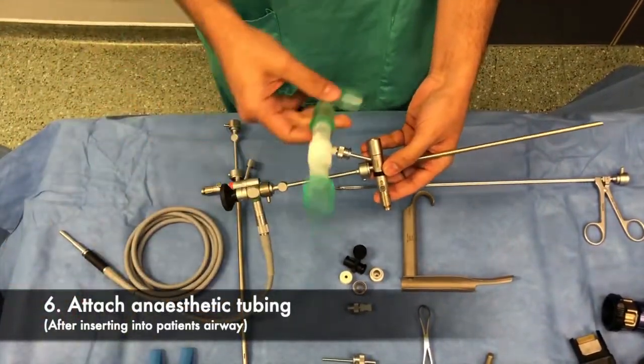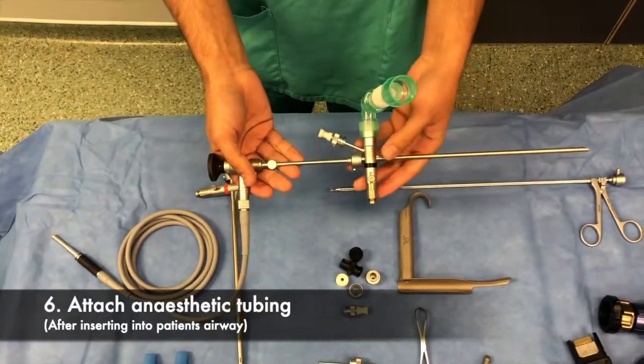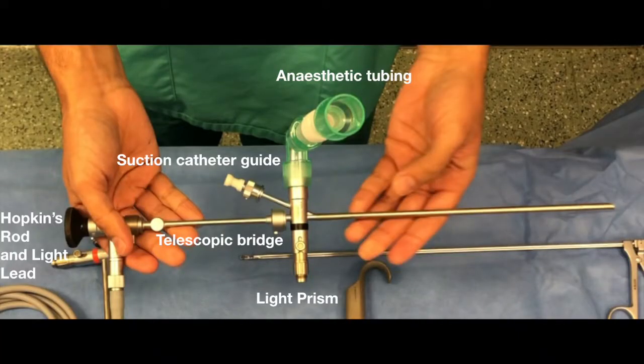Finally, once the bronchoscope is in place, anaesthetic tubing is attached here. This allows the patient to be ventilated. This image shows the final position for the setup of the bronchoscope when it is inserted into the airway.